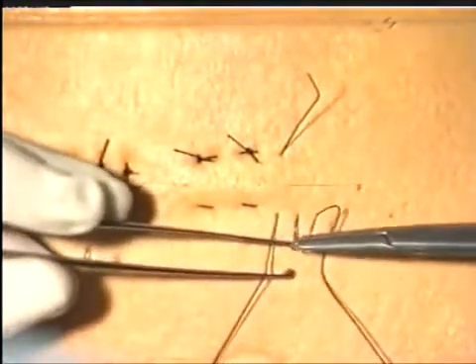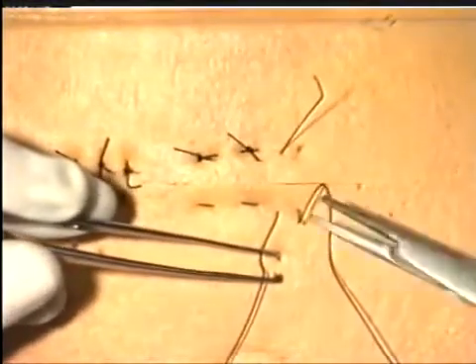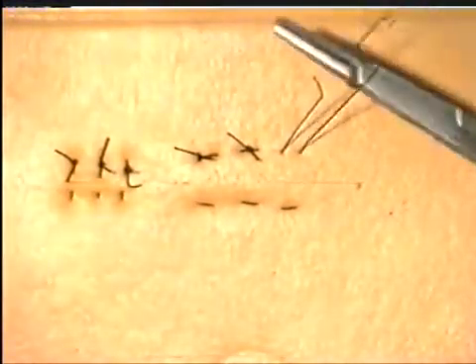The difference between the vertical mattress suture and the horizontal mattress suture can easily be seen in this demonstration.